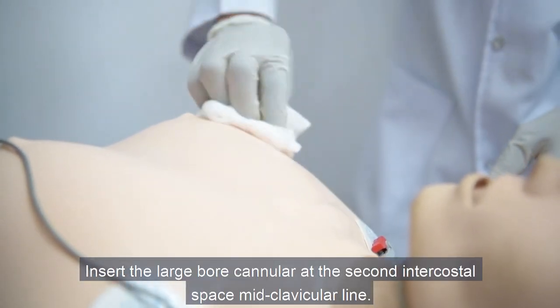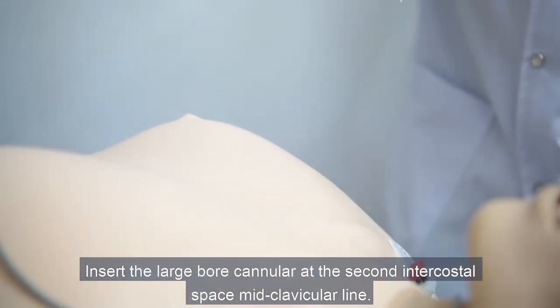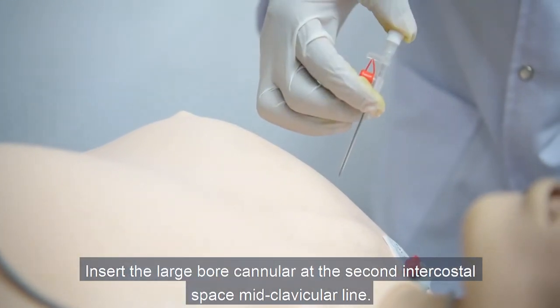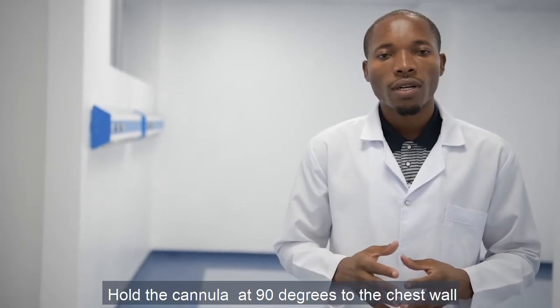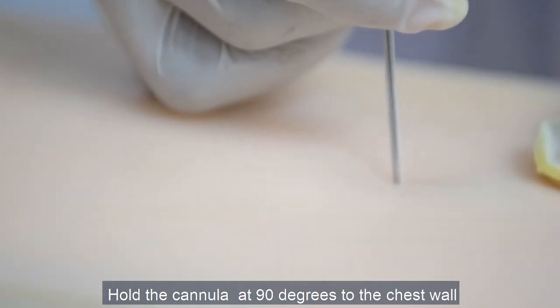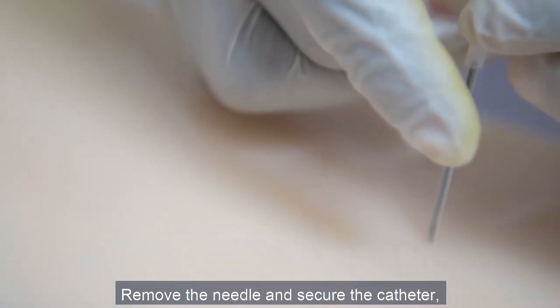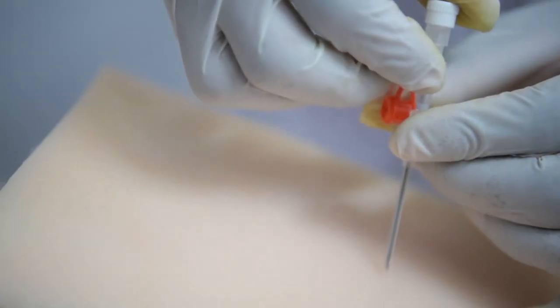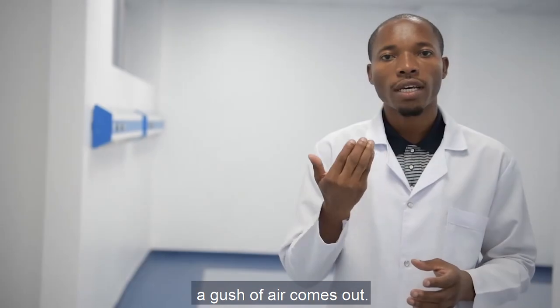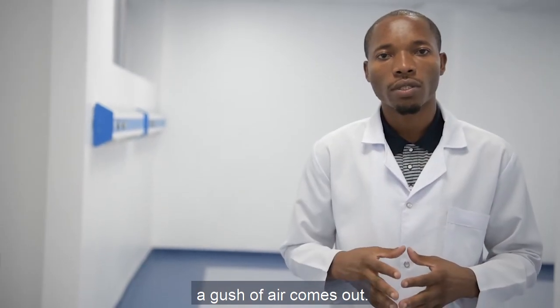Insert a large bore cannula at the second intercostal space, mid clavicular line. Hold the cannula at 90 degrees to the chest wall. Remove the needle and secure the catheter. A gush of air comes out.